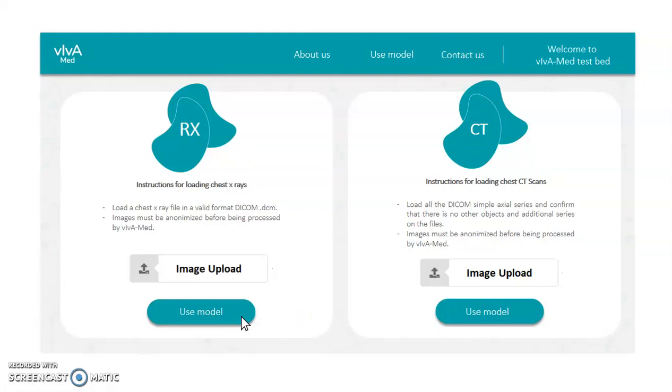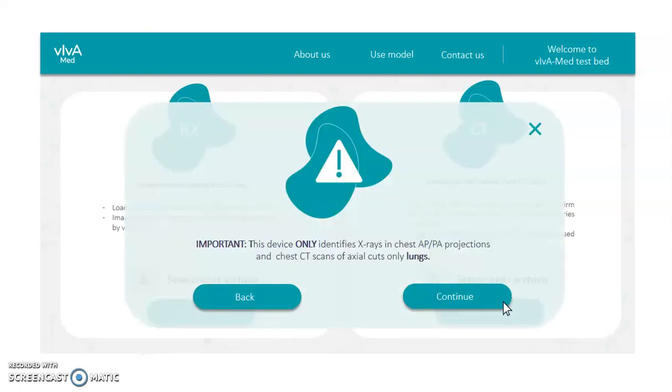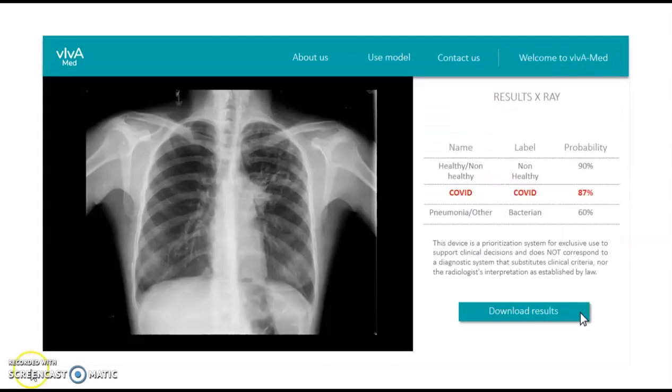Models for lung segmentation will produce masks at the pixel level of the images, where the lung region area is detected, and are used for image segmentation. The diagnostic model set will take the segmented X-ray and tomography images of each patient and will produce a binary diagnosis of COVID-19 compromise and probability of compromise.